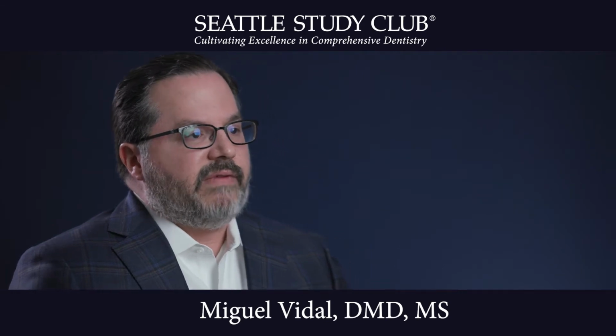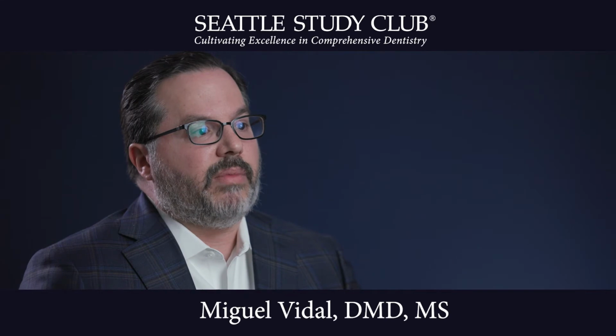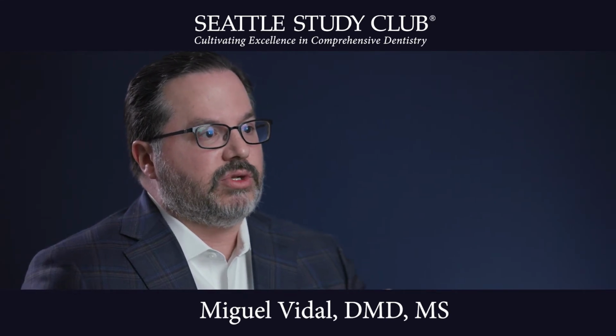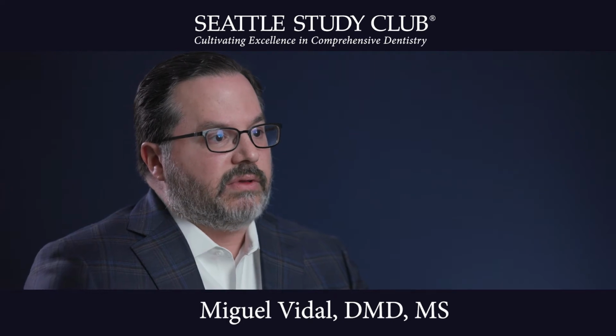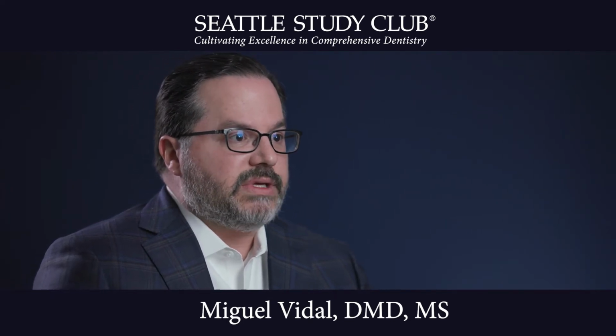So when we evaluate the tissue depth, that's going to be a critical factor in our design of our abutment and how much space we actually have available from the platform of the implant to the gingival margin process. So the more space we have, the better our outcome is going to be.